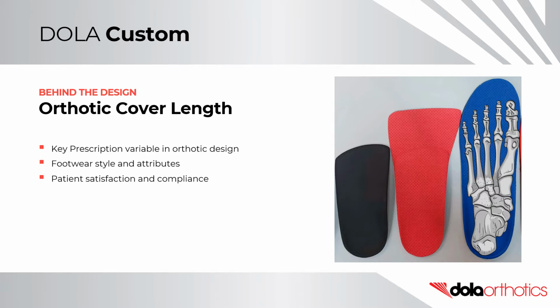Behind the design. Orthotic cover length. Orthotic cover length is a key prescription variable in orthotic design. It relates to the patient's footwear style and attributes, including whether there is a removable insole or not. Successful selection of your cover length can help with patient satisfaction and compliance with their orthotic therapy.